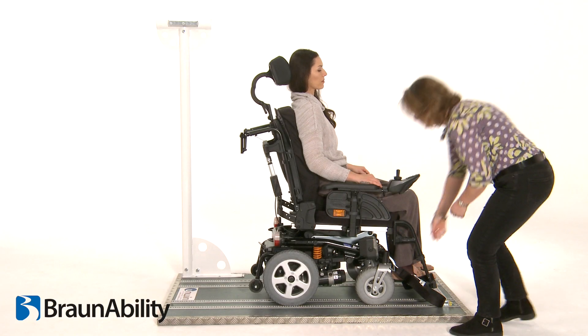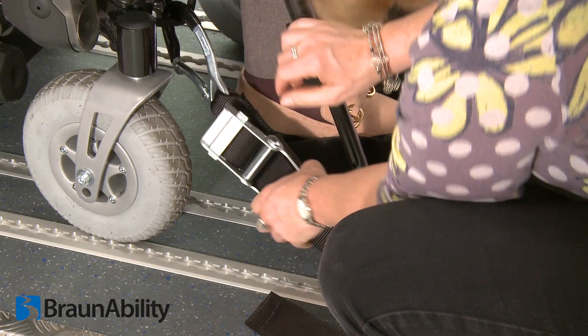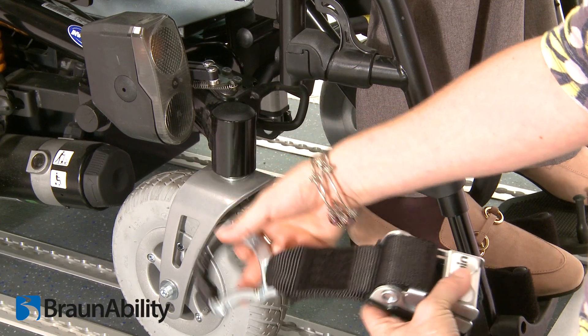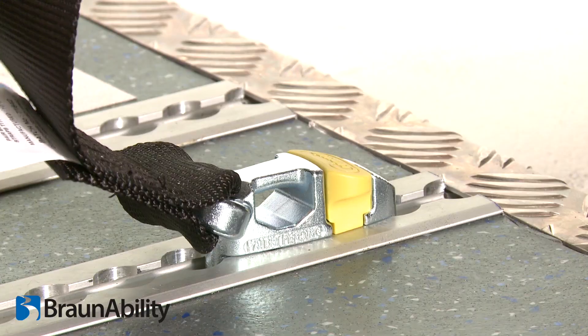To remove the Titan front tie-down, release the over-center tensioner as shown. Loosen the webbing and unfasten the carabiner from the wheelchair frame. Pull the webbing back, close the over-center tensioner, and re-secure the Velcro fastening.